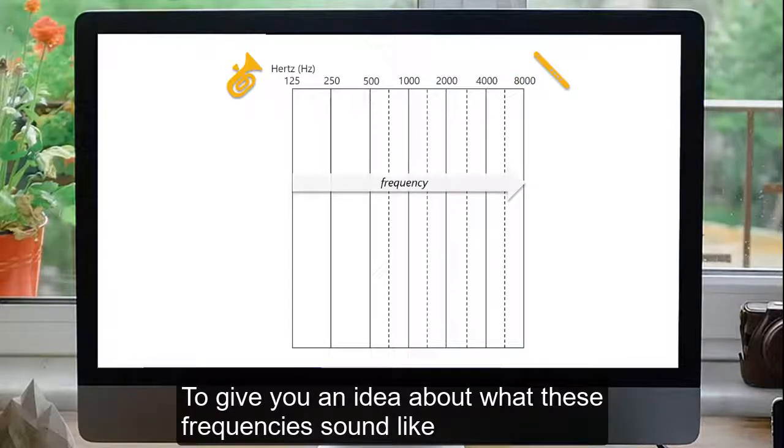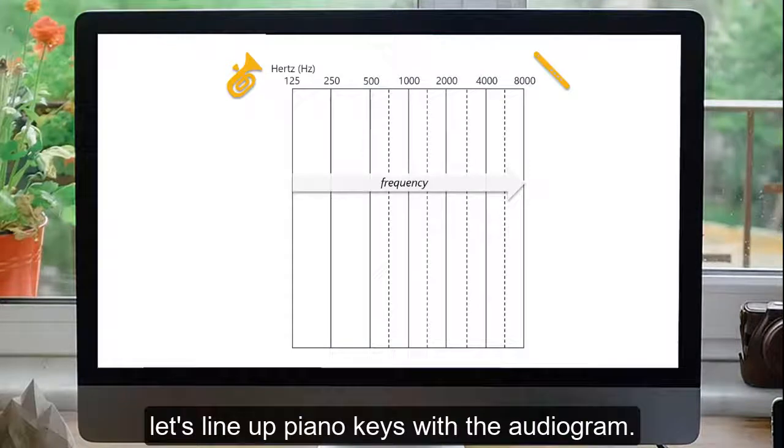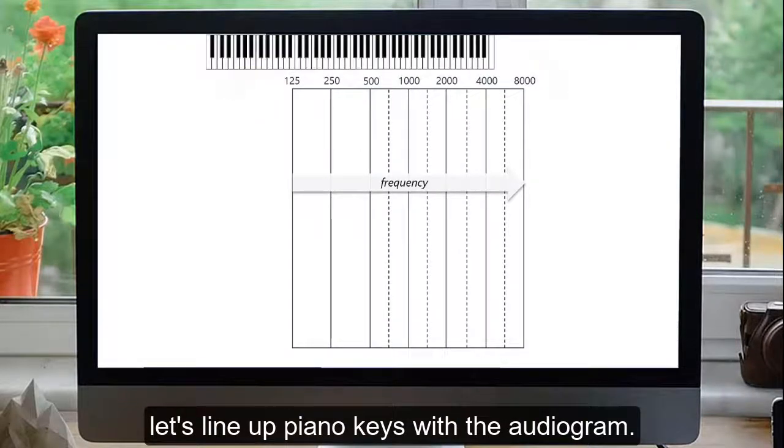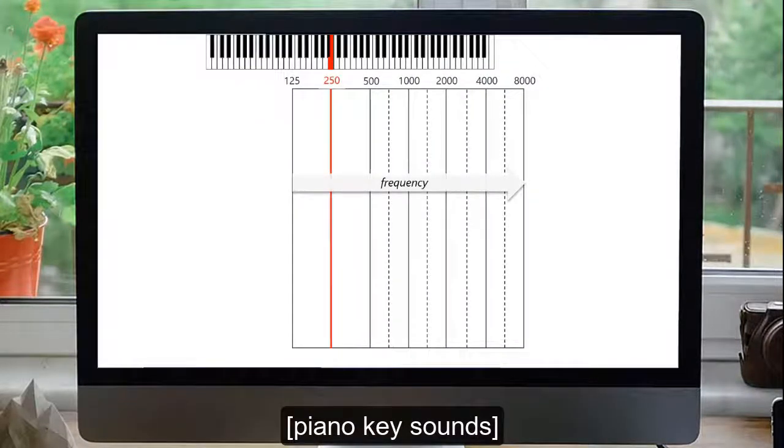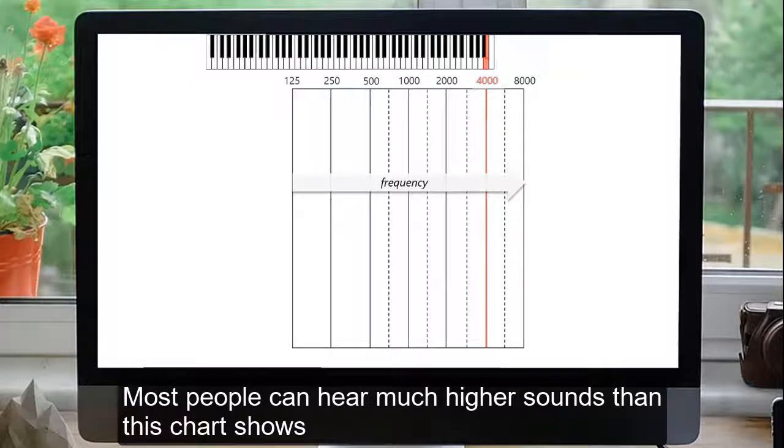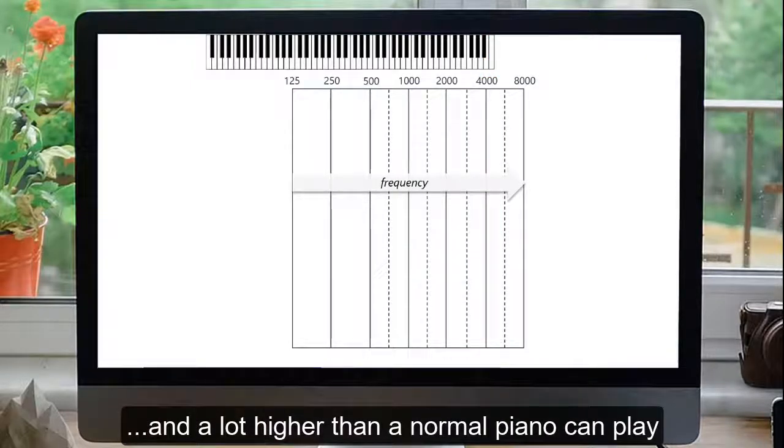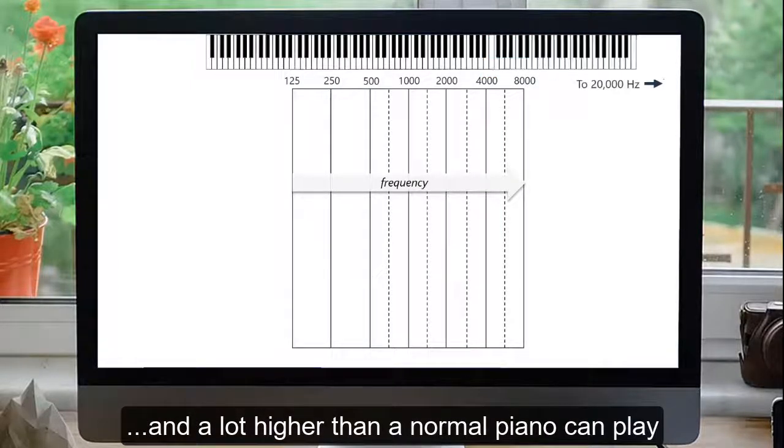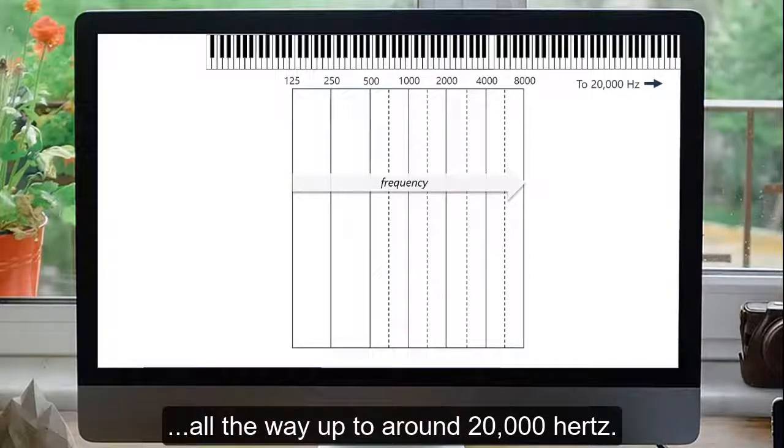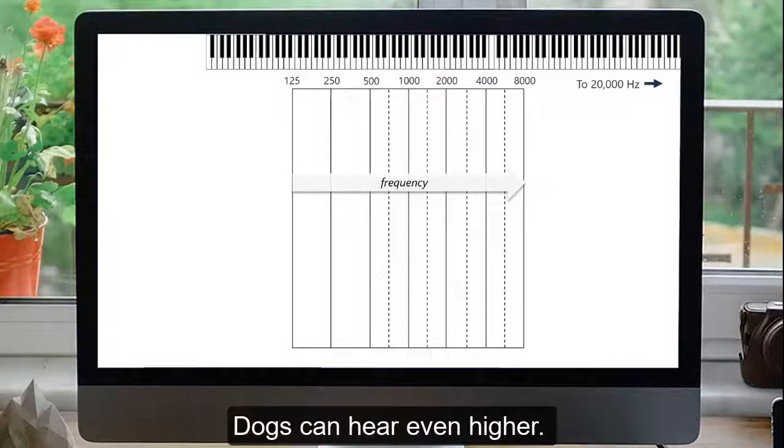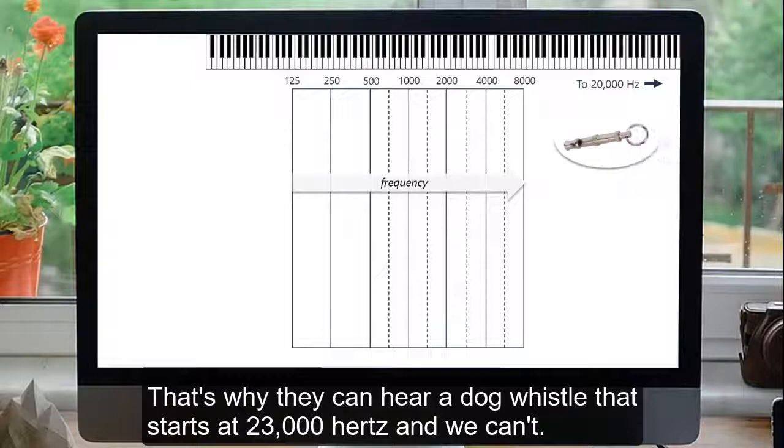To give you an idea about what these frequencies sound like, let's line up piano keys with the audiogram. Most people can hear much higher sounds than this chart shows, and a lot higher than a normal piano can play, all the way up to around 20,000 Hz. Dogs can hear even higher. That's why they can hear a dog whistle that starts at 23,000 Hz, and we can't.